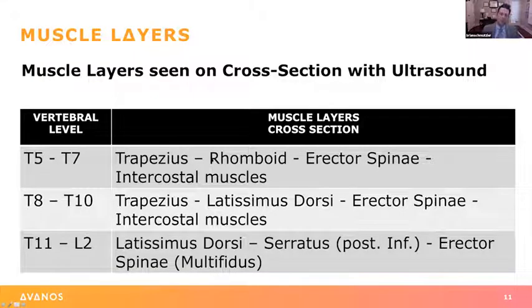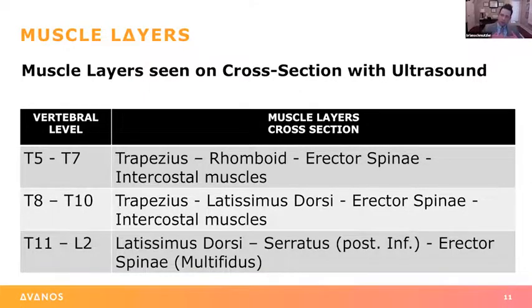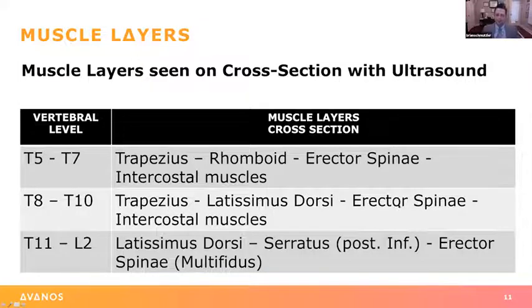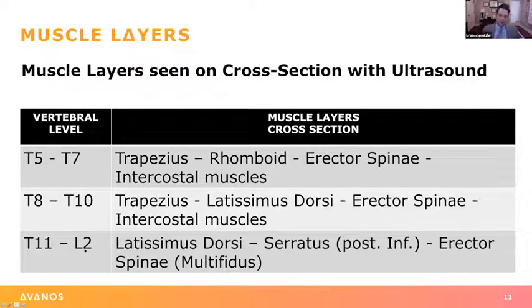What's interesting is that the muscles creating the sono anatomy change as you go from high thoracic to mid-thoracic to low thoracic and lumbar. Up higher, the top layer is the trapezius, often fairly large, with the rhomboids underneath and the erector spinae below that. If you go between the transverse processes underneath the erector spinae or intercostal muscles, that's too far. Further down, the rhomboid disappears and the lat comes in. The trapezius and lat have muscle striations that go different ways, so they're easy to tell apart. Under the lat you have the erector spinae and the intercostal muscles.